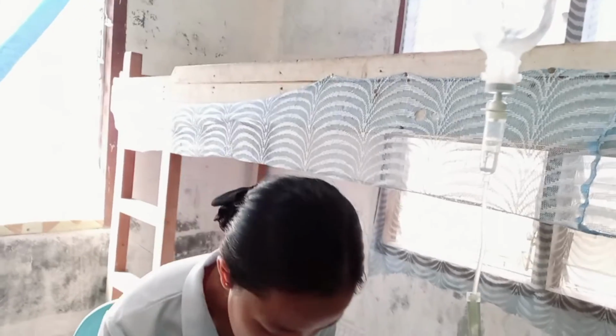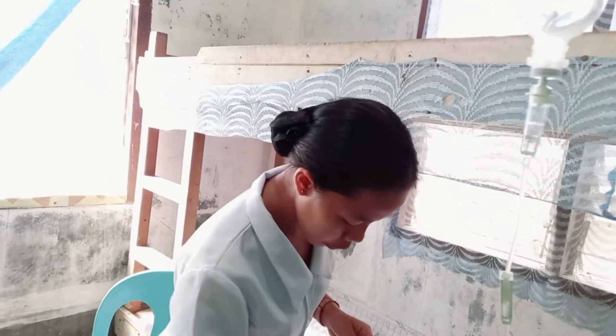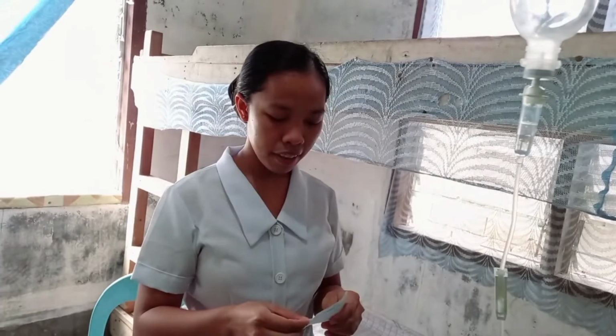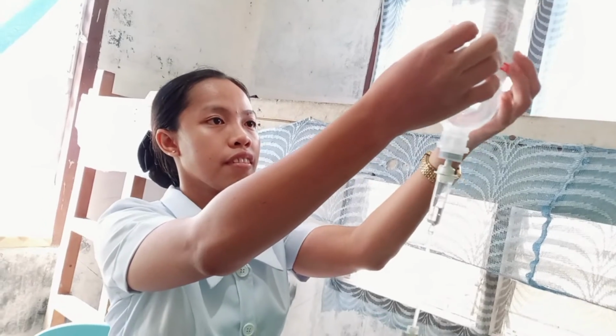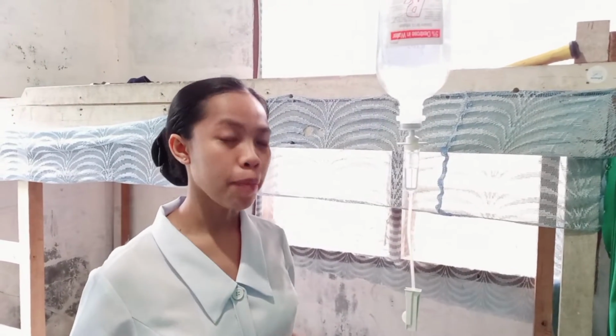Then we will complete the IV label. So we'll put the name of the patient, the IV tip, and the time started, and the date, and the signature. Then we will tape it at the back of the IV solution. So we will regulate the IVF according to drops per minute.